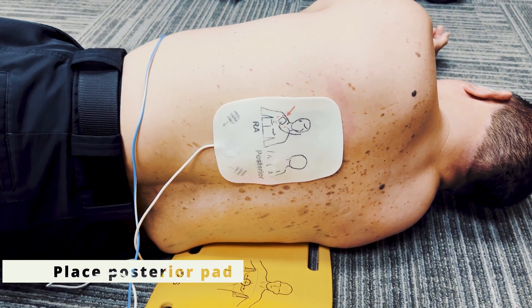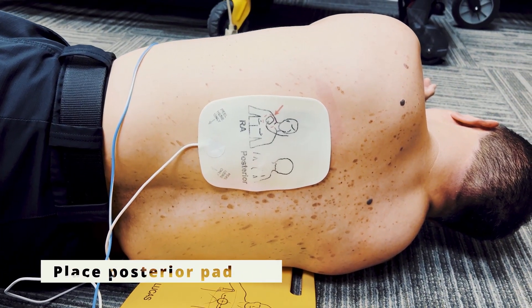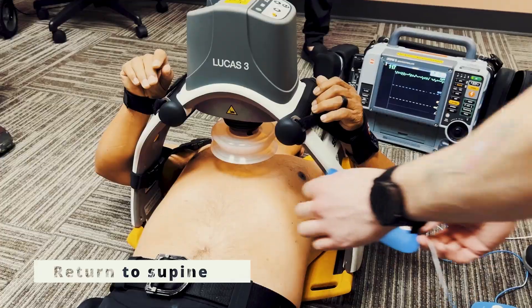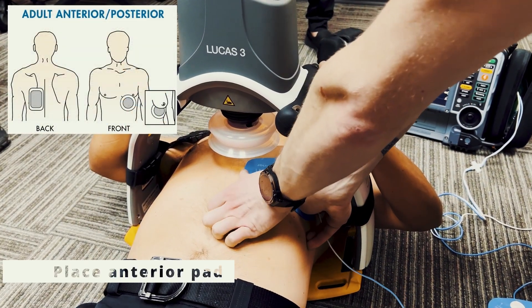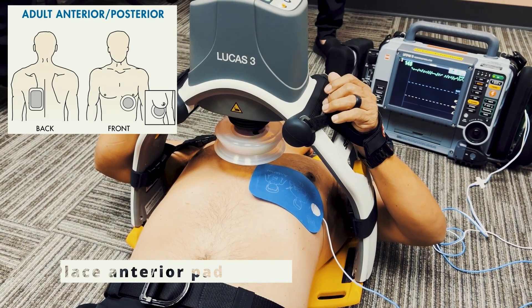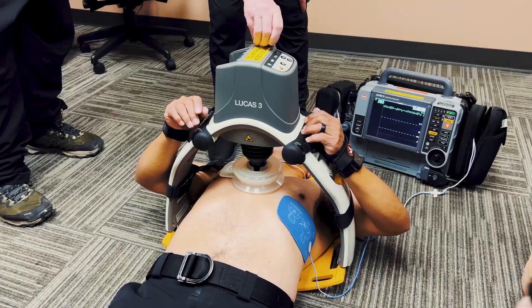Place the posterior pad between the spine and the left scapula at the heart level. Return the patient to the supine position. Place the anterior pad over the cardiac apex between the midline of the chest and nipple on a male, or under the breast on a female.